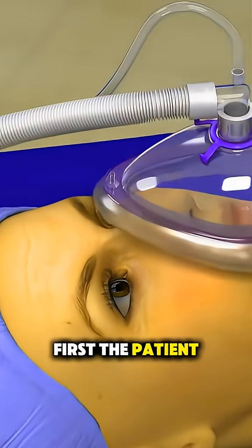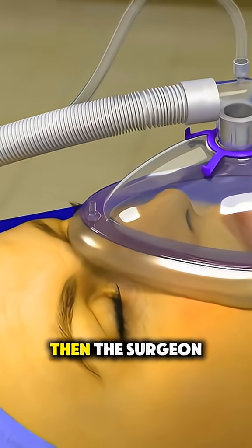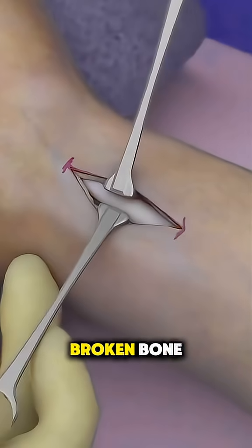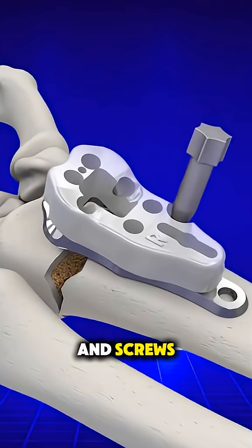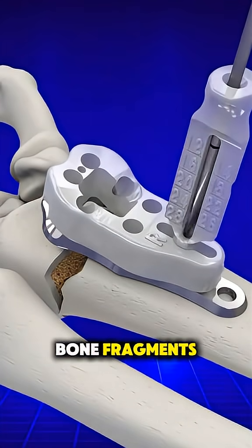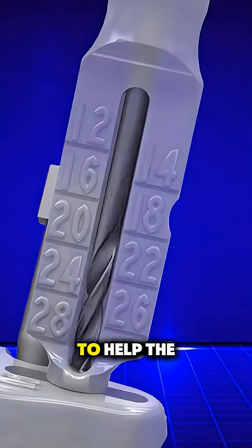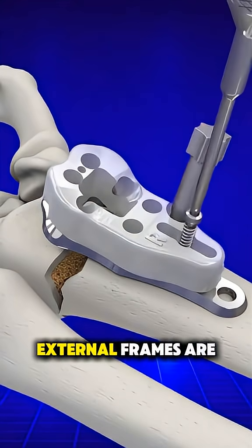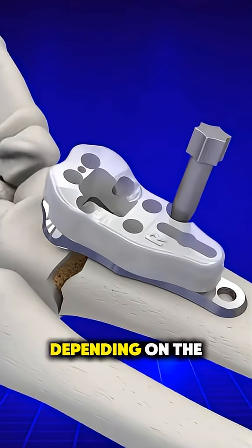First, the patient is given anesthesia. Then the surgeon makes a small incision near the wrist to access the broken bone. Using metal hardware like a plate and screws, they realign the bone fragments and secure them in place to help the bone heal properly. Sometimes pins or external frames are used depending on the severity.